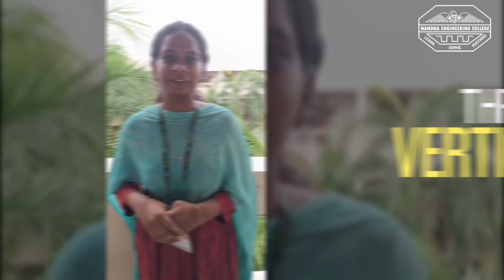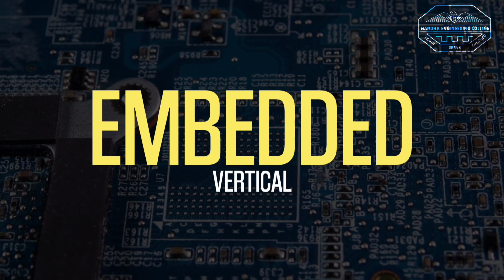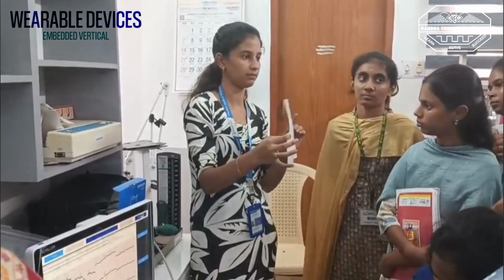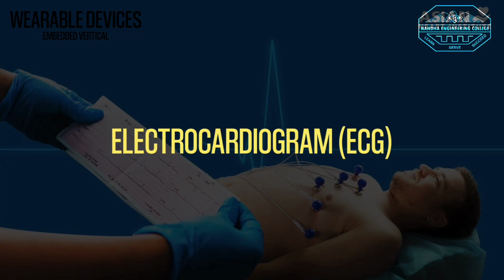In our department, we have 3 verticals: VLSI, Embedded and Communication. I belong to the Embedded vertical. In our vertical, we went on a field visit to Kasha Medical Technologies. In the medical technologies, we learned about various medical appliances like anesthesia, ECG, stethoscope, etc. Let's see one by one.